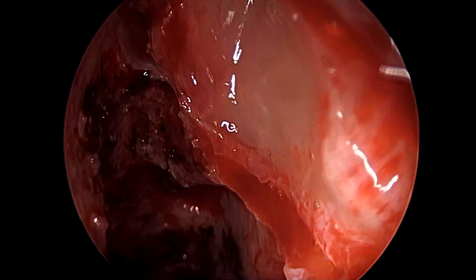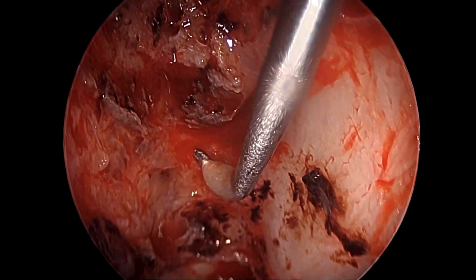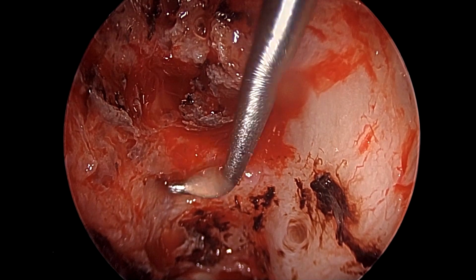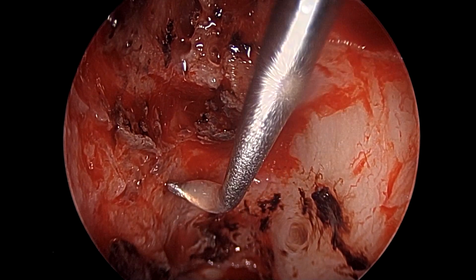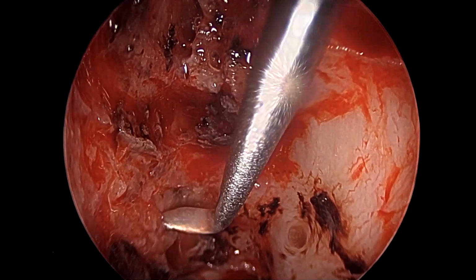It is obviously borne in mind that actual underlay grafting, which is done above the dura, is very difficult in these patients because the defects are small. One could never go inside the dura in these patients. So our primary or the first layer of fascial graft material would actually go between the dura and the bone.